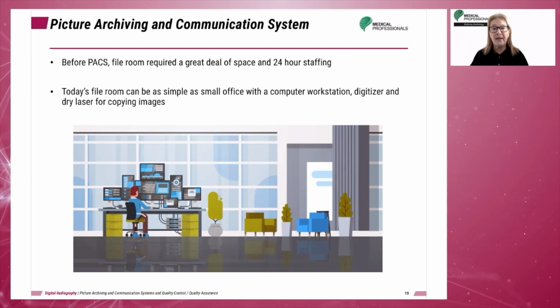In large medical centers, trauma centers, or teaching hospitals, the file room needed to be staffed 24 hours per day, every day of the year. Today's radiology file room can be operated out of a small office with space for a workstation, printer, digitizer, and dry laser for copying images.